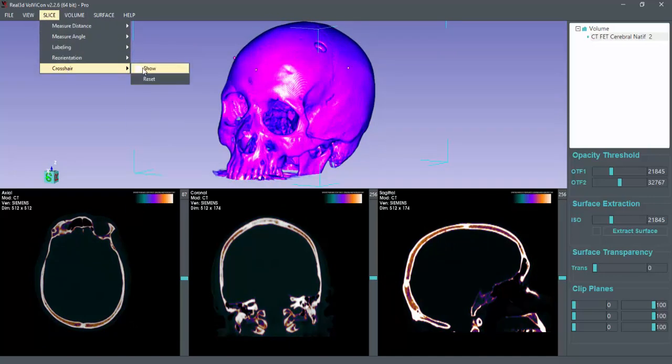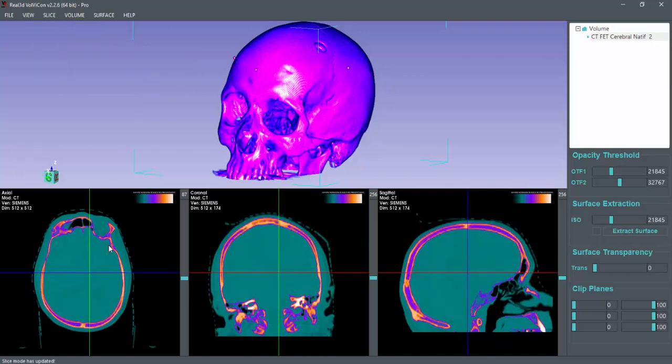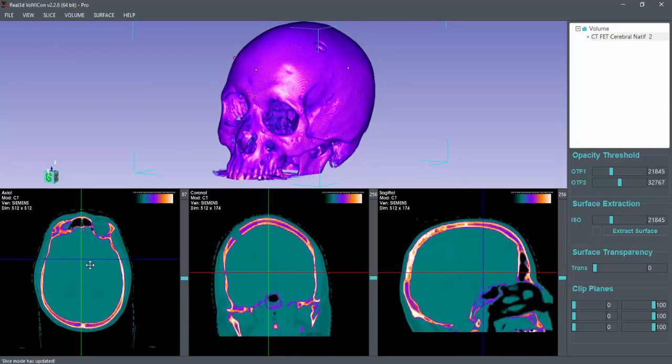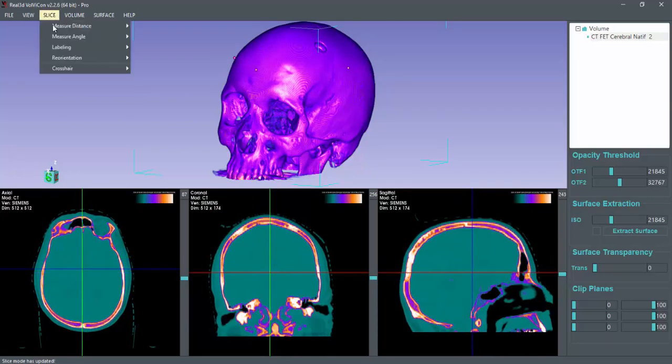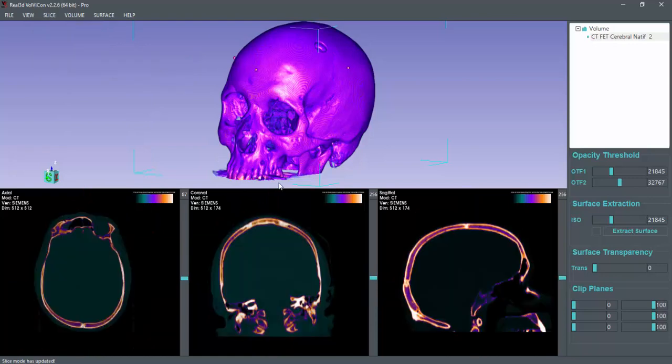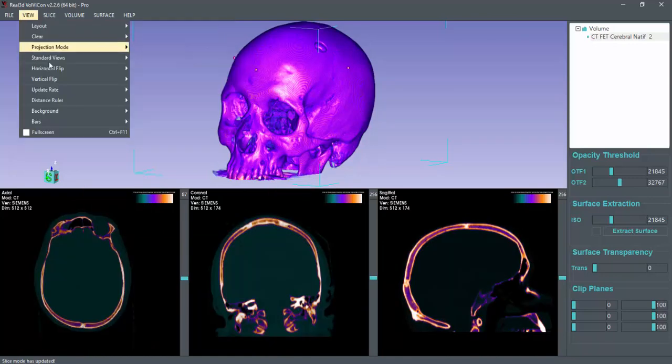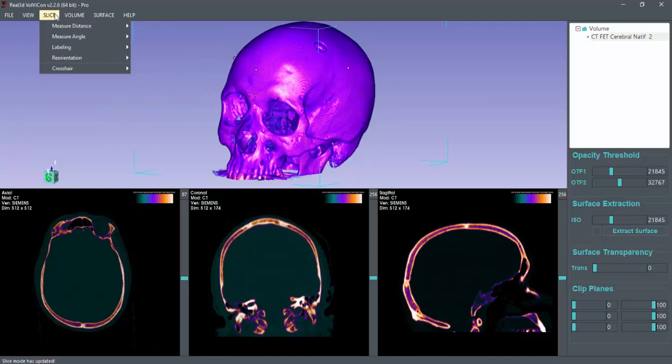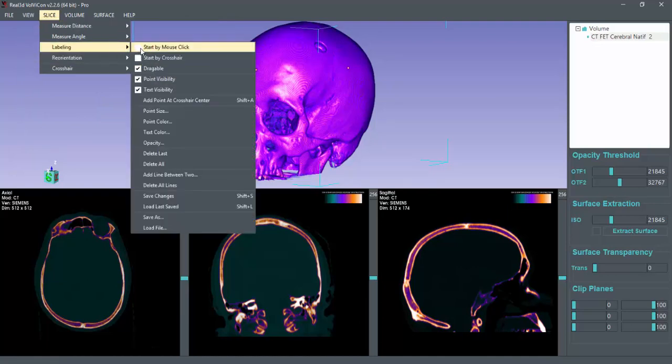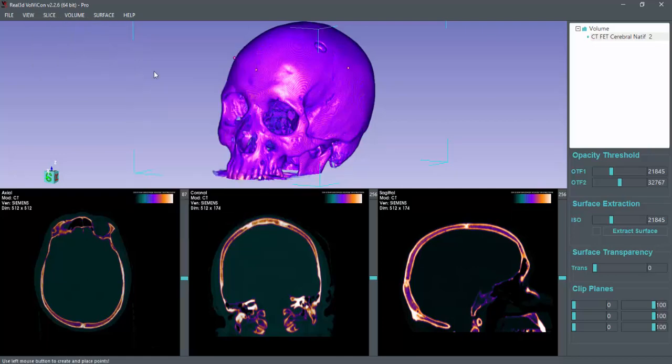The second crosshair can be utilized. You can enable or disable the crosshair and labeling feature. So now you can add labels using mouse clicks. Let me add some points.